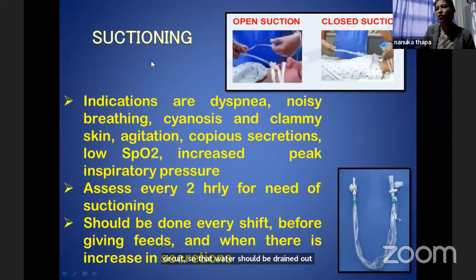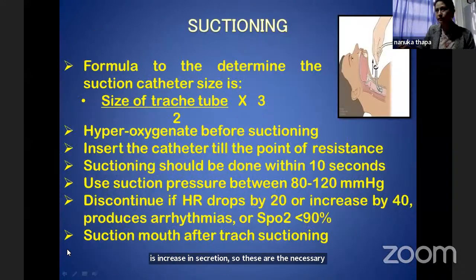So next is suctioning. The indications for suctioning are mainly dyspnea, noisy breathing, cyanosis, clammy skin, agitation, mucus secretion, low SpO2, increased inspiratory pressure. And you should assess every 2 hours for the need of suctioning, and it should be done every shift, before giving any feeds, and when there is increase in secretion. So these are the necessary things about suctioning.